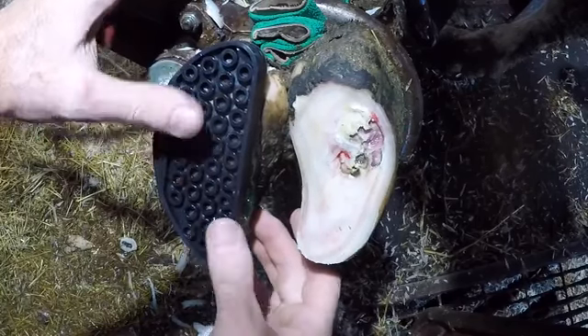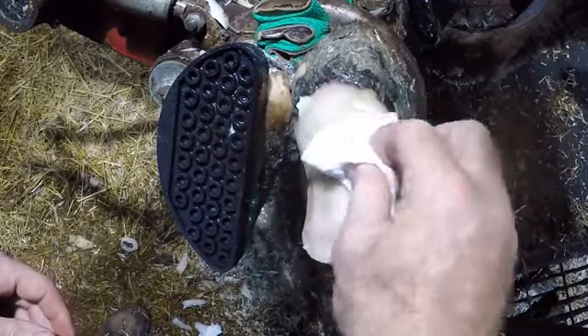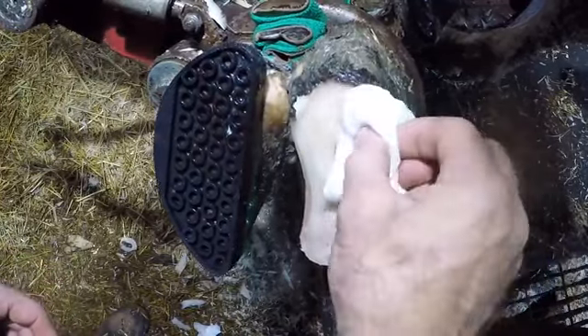With a lesion like this, we're going to apply a rubber block to the other claw, like we do with many different lesions — whether it be ulcers, abscesses, or in this case punctures caused by rocks. It's going to alleviate all of the weight from that injured claw and put it on the good claw. It gives this claw time to rest and time for that soft layer of horn to become hard and not put pressure on that corium from the bottom side. You can almost visually see where each pocket of rocks was — but this is all soft tissue and you don't want to be cutting into that. It's going to get hard over time. We've got this opened up now so we can get that infection out of there.